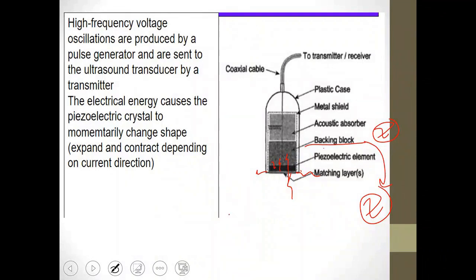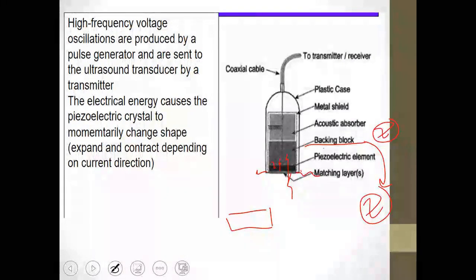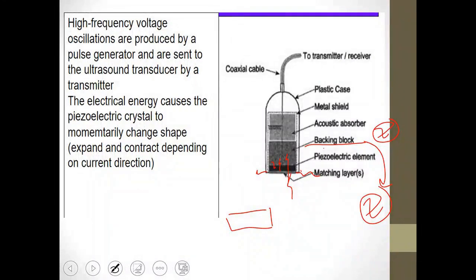The crystal, for me, works like this. All right? I say that the thickness of the crystal should essentially equal half of the wavelength. So if I increase my crystal a bit, what will happen? Simply put, if I say half, I mean half of the wavelength.